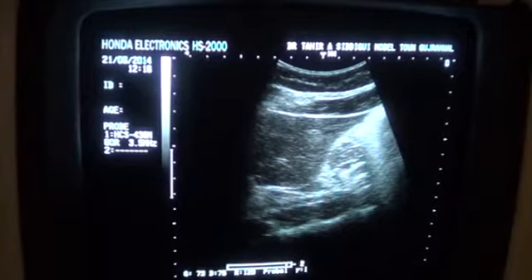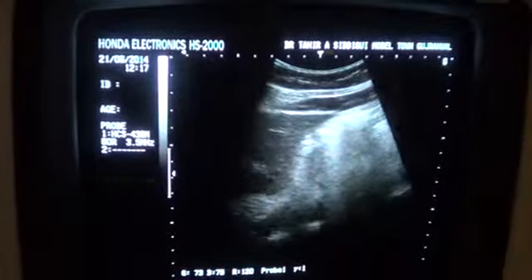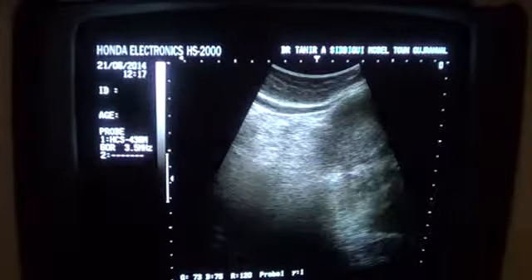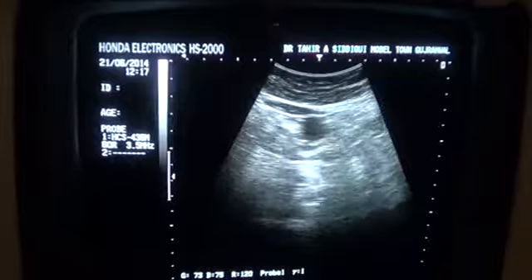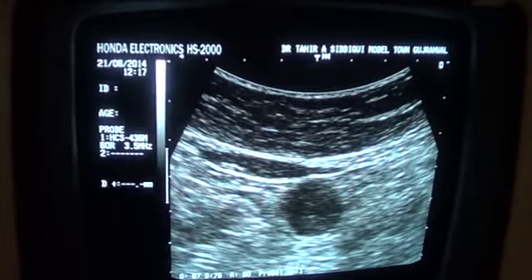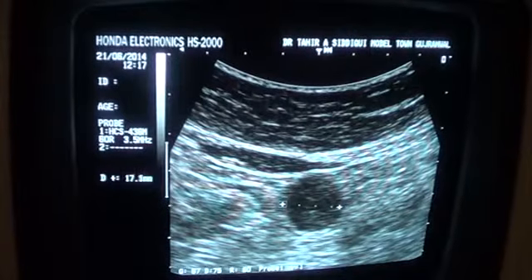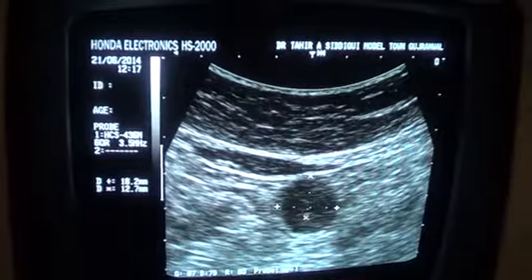The superior mesenteric artery, the aorta, the liver angle, the left lobe of the liver in longitudinal section, and this cystic area that we are seeing is possibly representative of a necrotic lymph node. This is a small lymph node adjacent to this solid mass, measuring 18.2 mm.